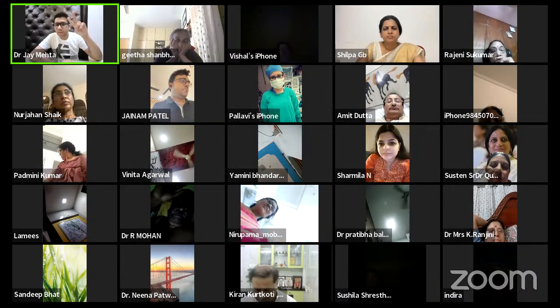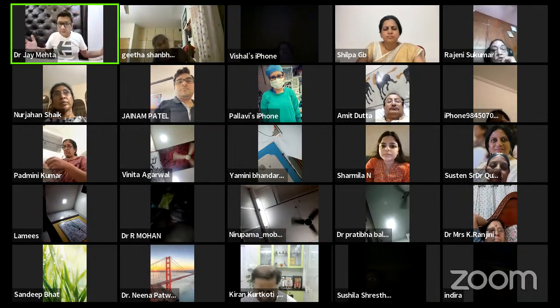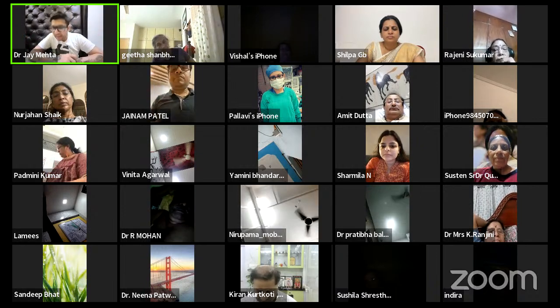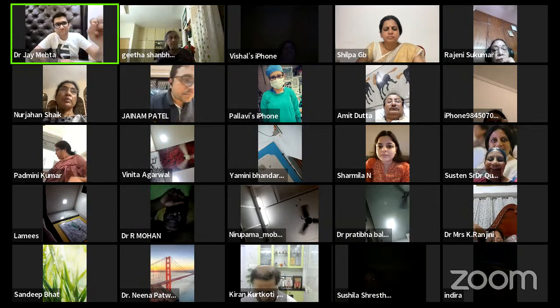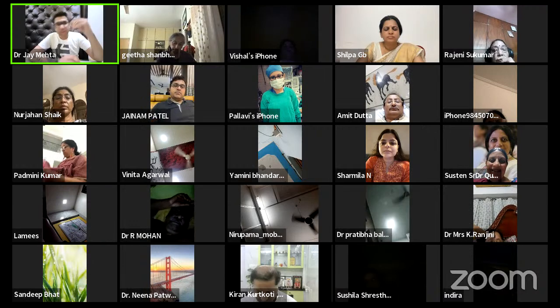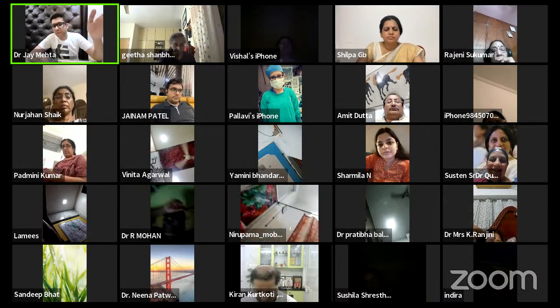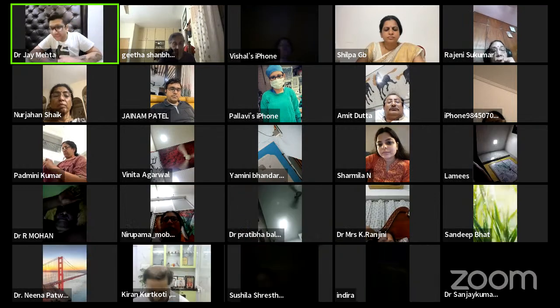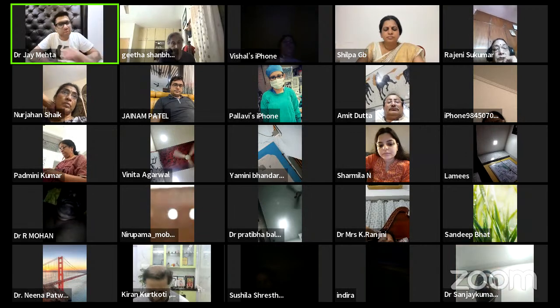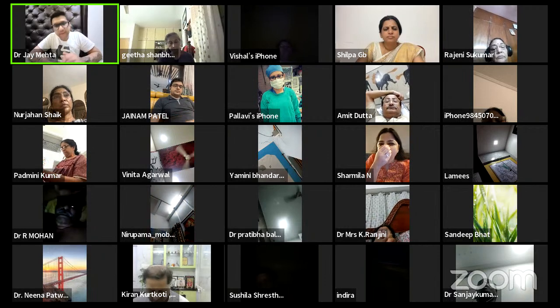The second thing which people will ask in this is, but the endometrium is fluffy, and you can't really identify so many things on the day of the ovum pickup. The day you start doing a hysteroscopy with your ovum pickup, you will realize what I'm saying is true. It's very easy. You will identify the polyp as a polyp, fibroid as a fibroid. You will identify everything, and you will be able to treat the pathology in a single anesthesia. Should you think you need to do that, you will easily identify septums. You will be easily able to cut the septums on the same day. So don't worry about it. That is one thing.